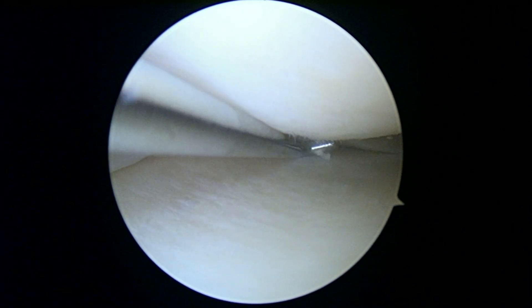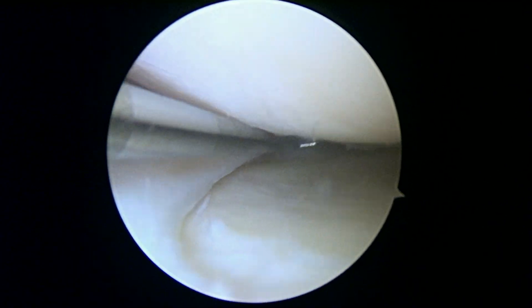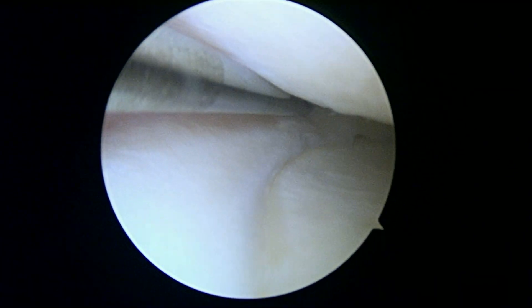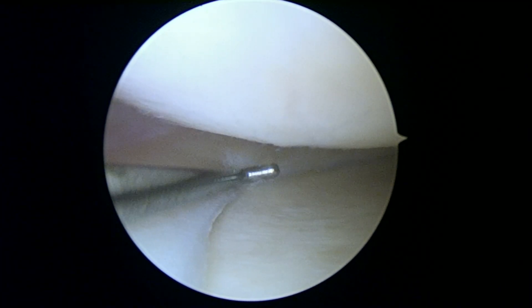We're looking in the medial compartment and from the MRI scan the tear extends — it's right there, I'm falling into it right there. It's just smaller than we thought. We may just do a little bit of a partial meniscectomy, especially given the arthritic change in the rest of the knee.